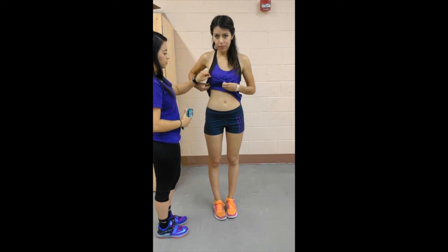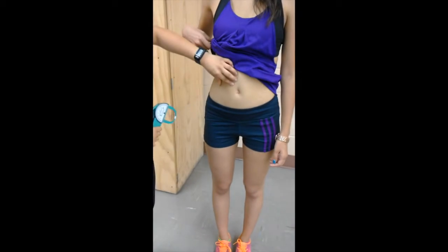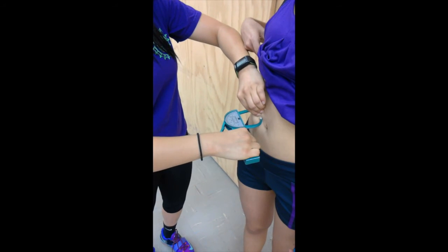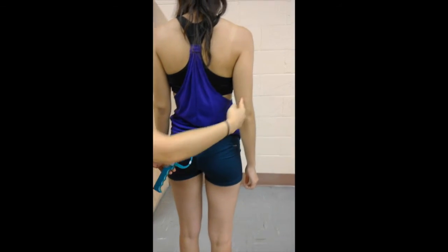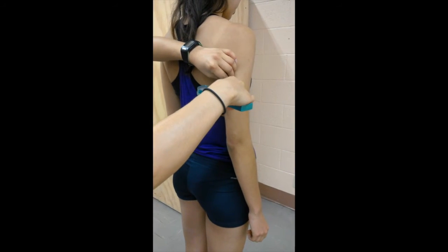The abdominal site will be measured 2 cm to the right side of the umbilicus at a vertical fold. The tricep site will be measured on the postural midline of the upper arm, halfway between the acromion and olecranon process, with the arm held freely to the side of the body, at a vertical fold as well.